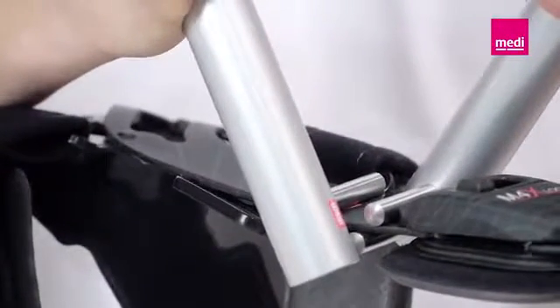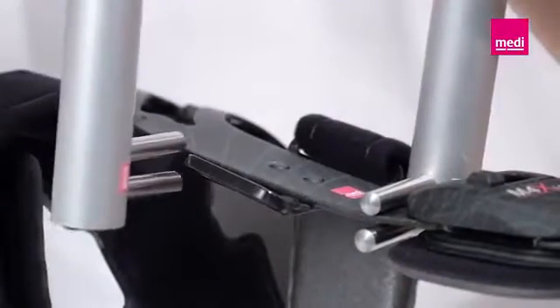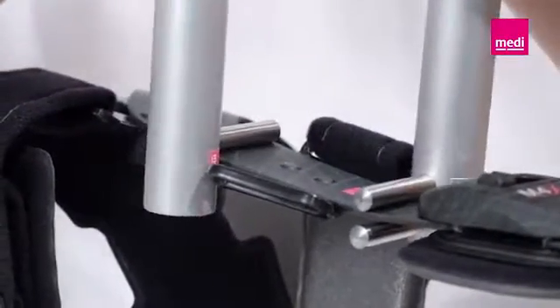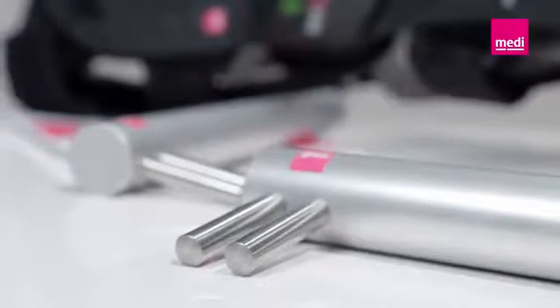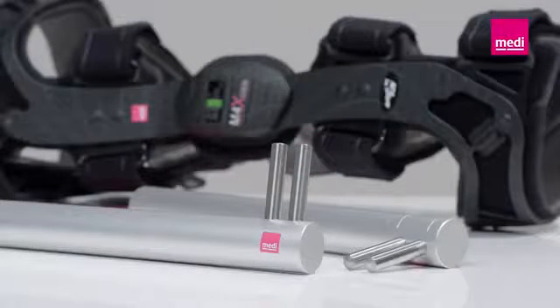The closer you set the bending tools together, the more acutely the orthosis frame bends. Increase the distance between the bending tools to achieve a softer correction line. Always use rounded bending tools to avoid damaging the frame. Remember that a closed system, like a rigid frame brace, can only be bent a certain amount. Mold the orthosis in small increments to match the contour of the leg and avoid overcorrection.